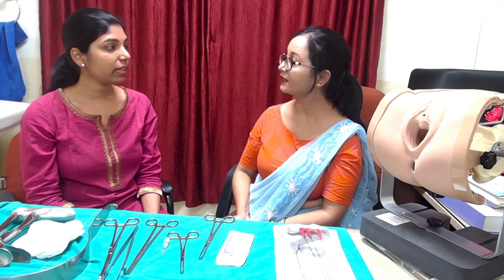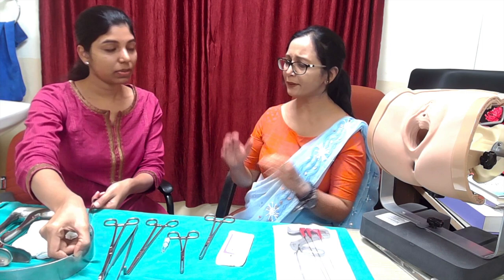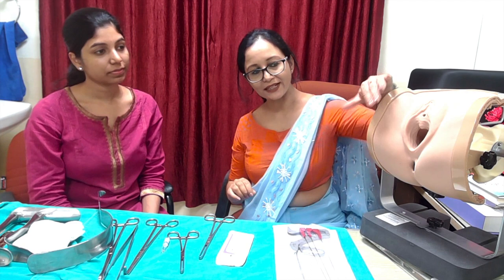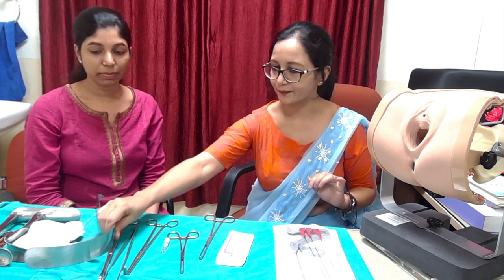To visualize the space properly, you need at least three long-bladed retractors. Three is the ideal number — two won't give you enough space and four is too many. One blade should be parallel to the sacrospinous ligament, one to separate the rectum, and one to separate the bladder and other anterior structures.